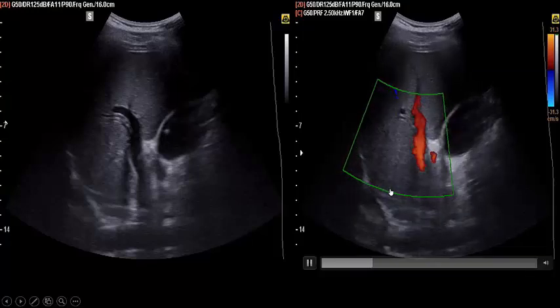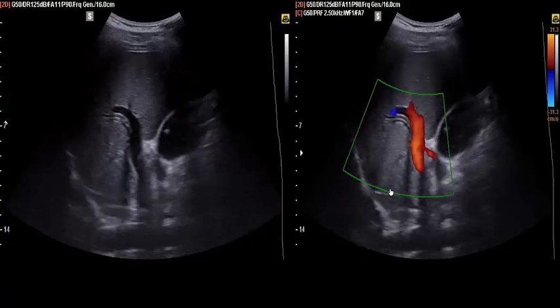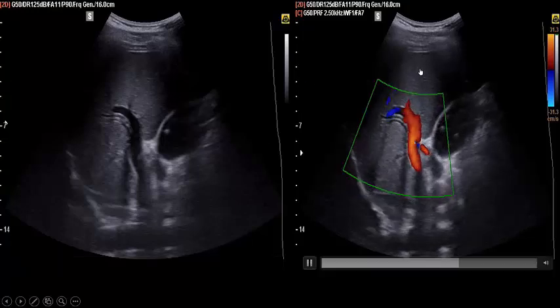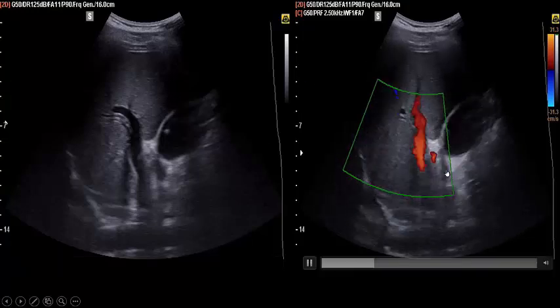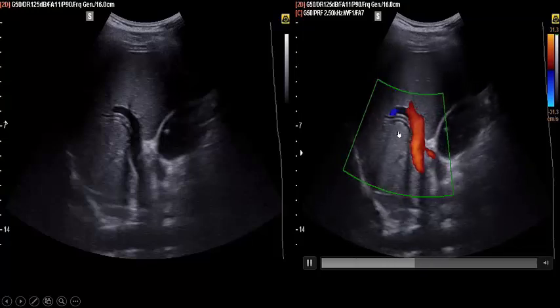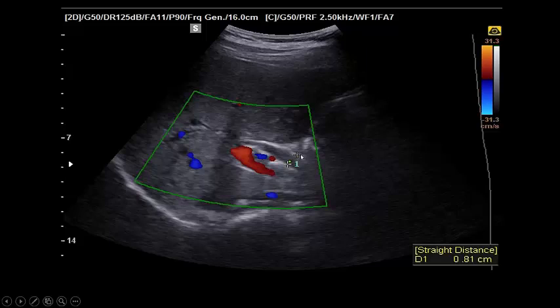So our patient has persistent biliary pain, not relieved completely by analgesics, and by examining the porta hepatis, there is dilated common bile duct with intrahepatic biliary dilatation and dark urine. I need to measure this common bile duct. In this ultrasound, it's 8.1 millimeters. I know the previous one was 3.7.